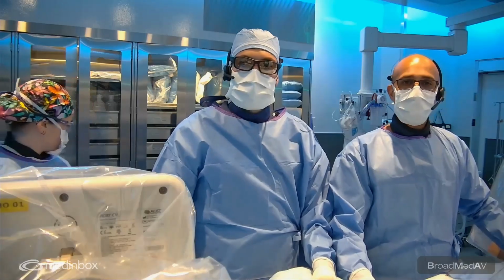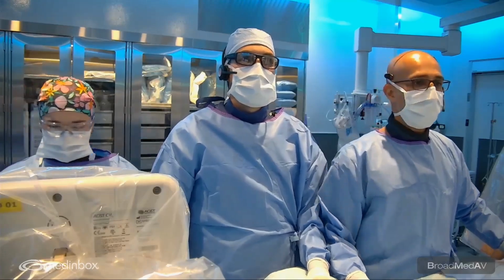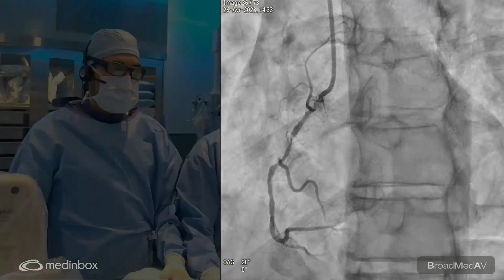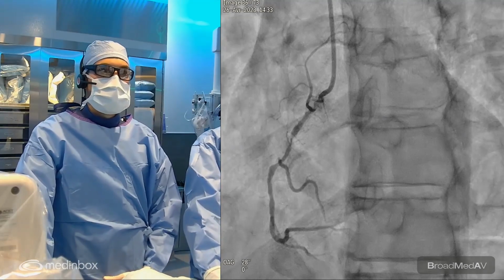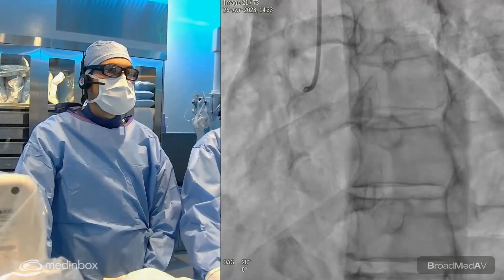So we've had quite a bit of time to start off the RCA, and it's a very interesting angioplasty that I'd like to go over. We did it just before coming online. So can I have the first image, please, of the angio? So our setup is a right radial Slender sheath, 7 French. I took the 7 French mainly for the left system.